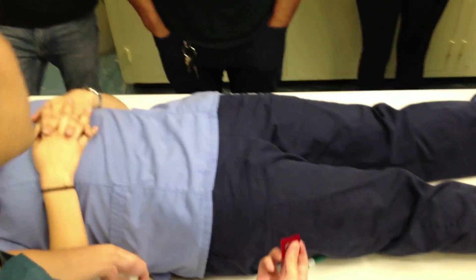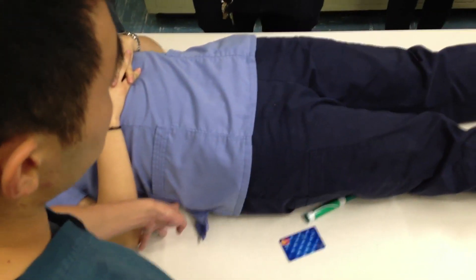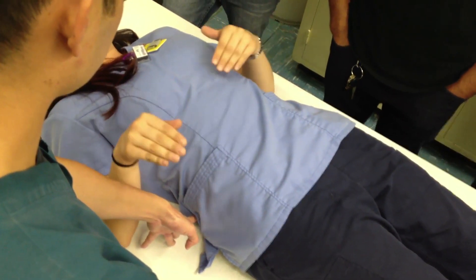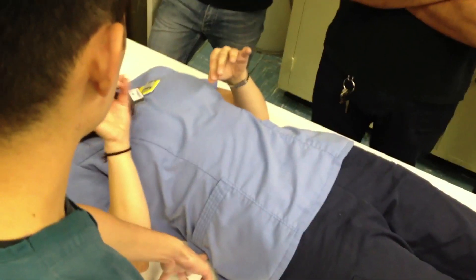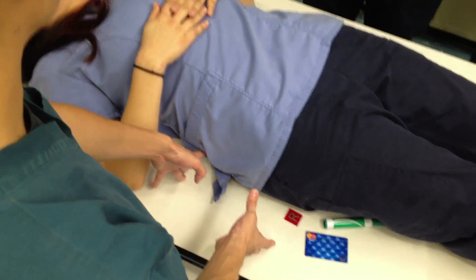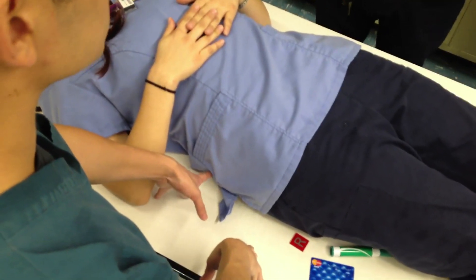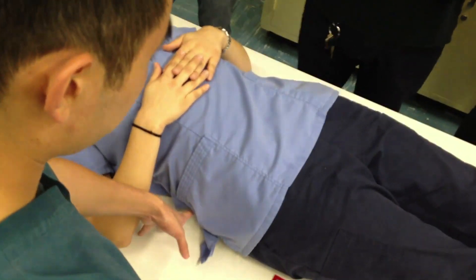For the pelvis, which marker would you use? I always just use the right side. If they're facing up, I use right and place it next to their right side. The best thing to do is place the marker that's closest to you, so you can be faster with positioning. And if you're doing a right hip, position the patient so the right hip is closer to you — same for the left hip — so you don't have to bend over and hurt your back. That's it for the pelvis.